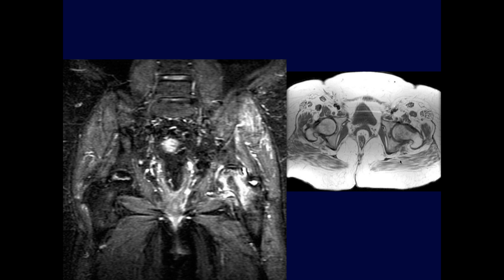Sarcopenia — severe muscle atrophy with fatty replacement — is demonstrated. All muscles appear markedly atrophic and low volume with fat infiltration throughout. In severe sarcopenia, muscles become friable and weak, so normal minor activity can produce muscle tears, pain, and inability to control bones properly, leading to increased fall risk and bone injury risk, often compounded by osteopenia.